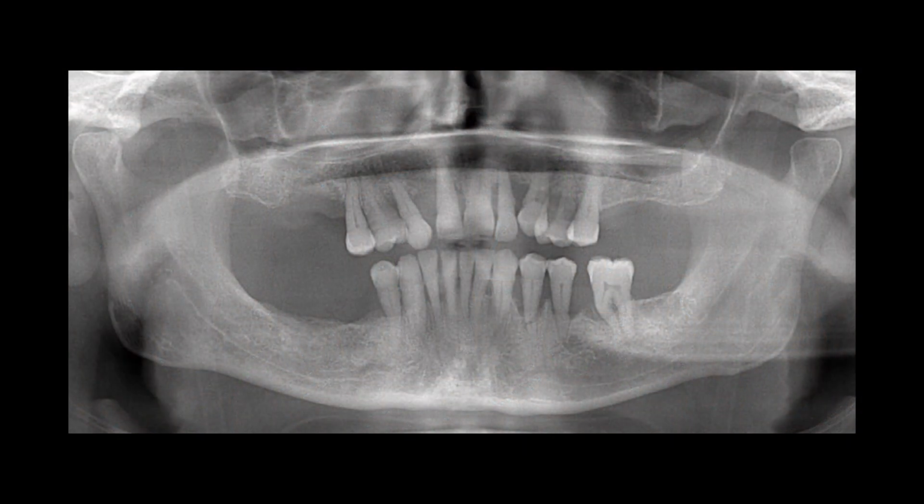So this is his preoperative panoramic image, and you can see almost 100% bone loss on the left lateral incisor, tooth number 10, and generalized bone loss ranging from 30 to maybe 80% on all his other teeth. But in general, his bone volume is good. I look past the bone loss around the teeth, and I look at how much bone remains, and this is where this type of philosophy or protocol that I've developed over the last 30 years, it's what I would want in my own mouth. Unlike the doctors who do all on 4, who would never have that treatment in their own mouth.